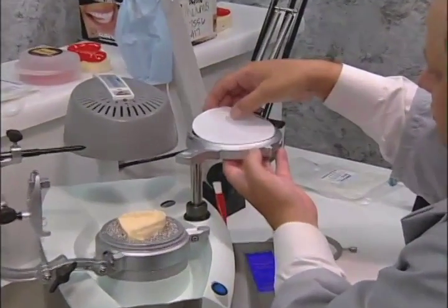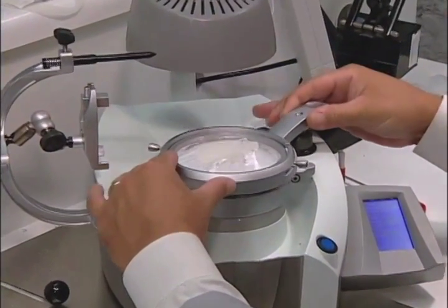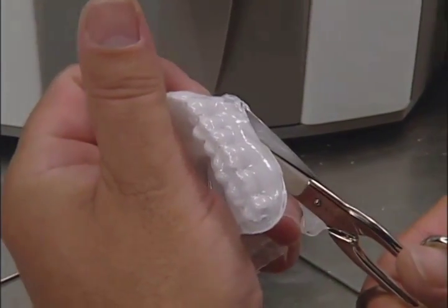Put in the disk and reattach the foil securing ring. After heating, thermoform the first layer of 2 mm ErcoFlex. Remove the model and trim as shown using the special scissors.